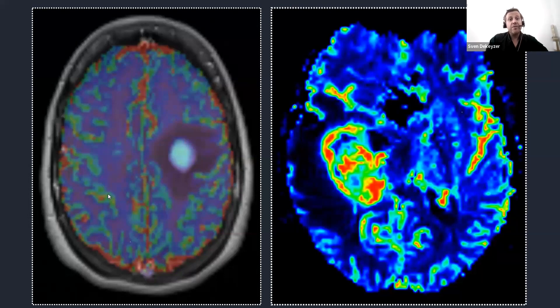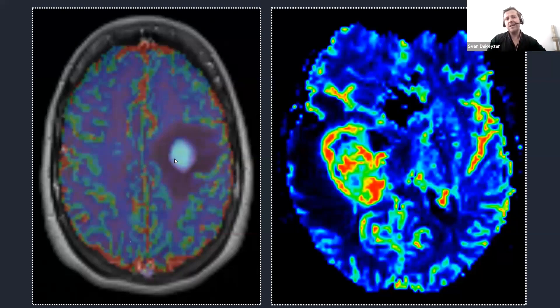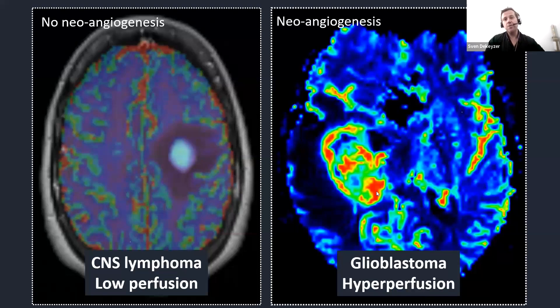A further characteristic of lymphomas is that the tumor is not associated with neoangiogenesis — the process by which a tumor develops its own blood vessels, especially seen in glioblastoma. Because lymphomas don't do that, on perfusion MRI the tumor rarely shows hyperperfusion. It always shows hypoperfusion — a low perfusion — especially when compared to very hypervascular tumors like glioblastoma.